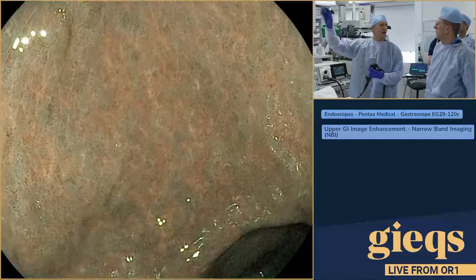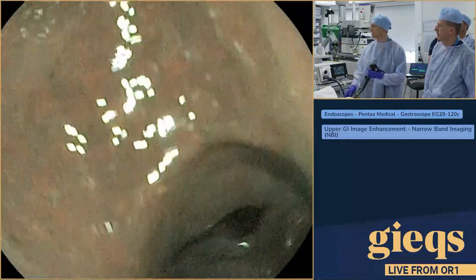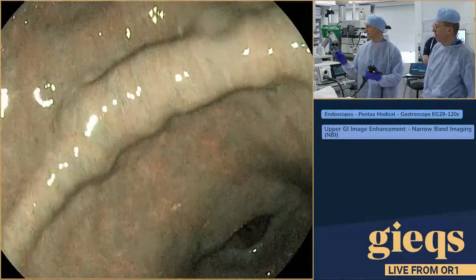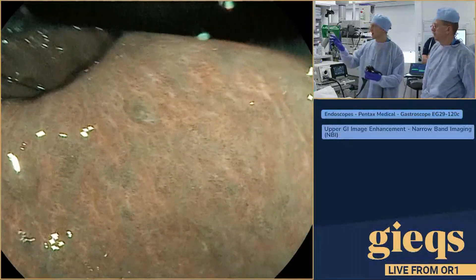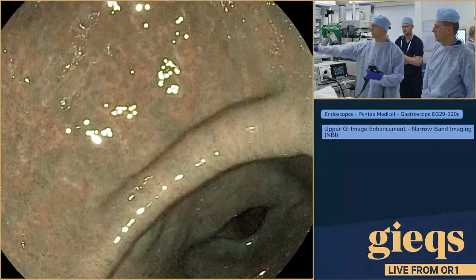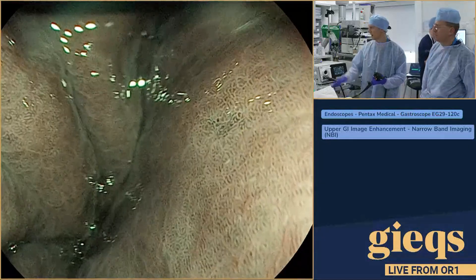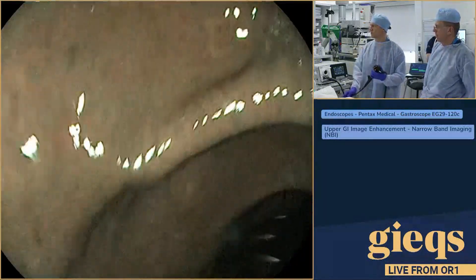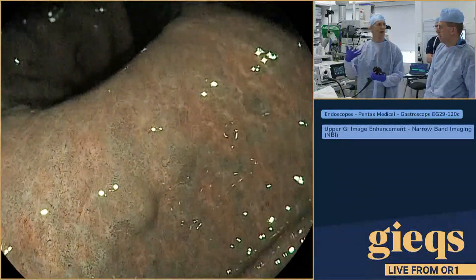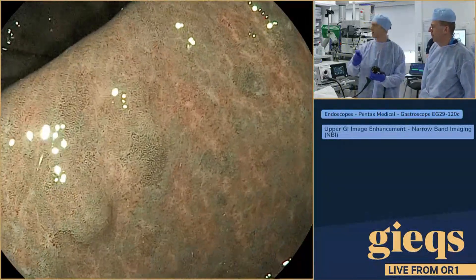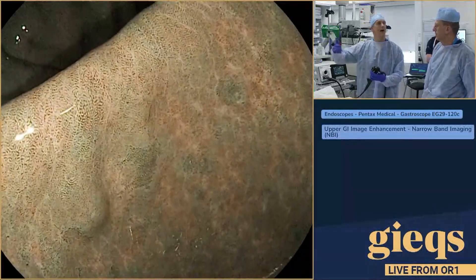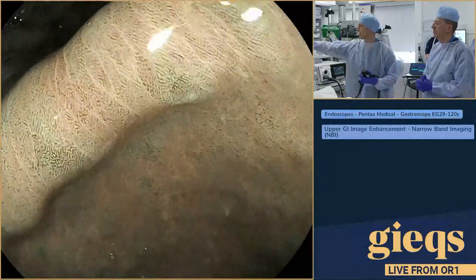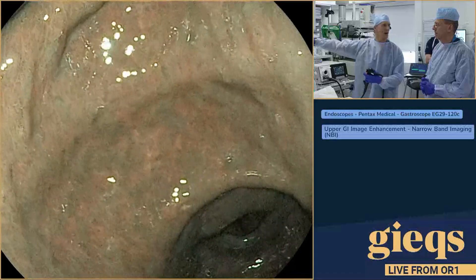So then you have to start thinking about taking more proximal biopsies to make a diagnosis. We would follow the Sydney classification or the combined Kimura-Sydney classification, in which case we would take biopsies from the antrum, the incisura, the lesser curve, and the mid-greater curve. If you take blind biopsies, you may miss areas of intestinal metaplasia or atrophy and understage the patient. So what you aim to do is look for areas where intestinal metaplasia is most prominent and target your biopsies from those.